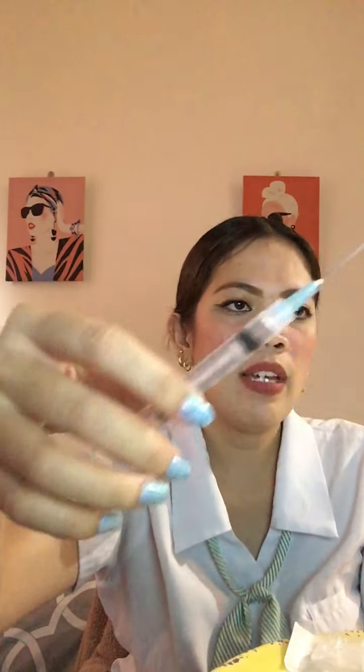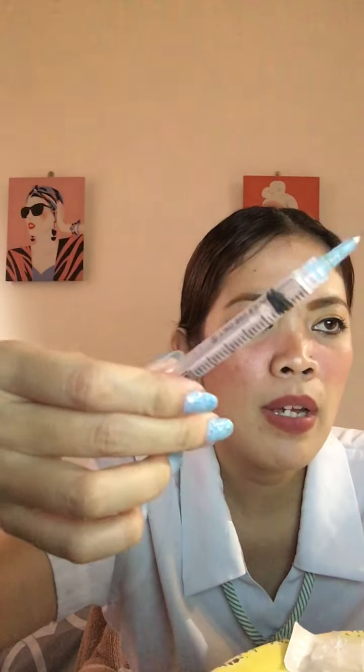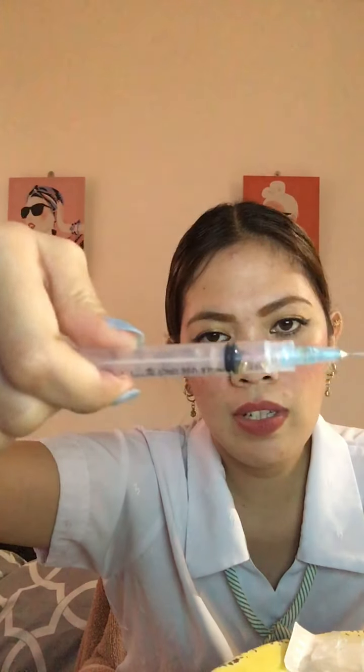So if there is a bubble, then it will be more painful. Now, grasp the syringe in your dominant hand. So this is my dominant hand, close to the hub, holding it between the thumb and the forefinger. So this allows easy handling of the syringe. So like that. Grasp the syringe in your dominant hand, close to the hub, holding it between the thumb. So like this. This allows for easy handling of the syringe.